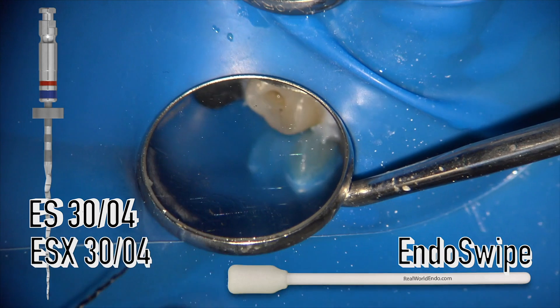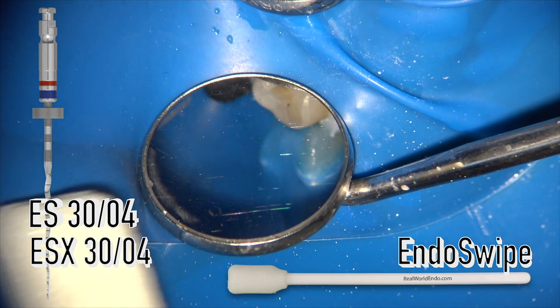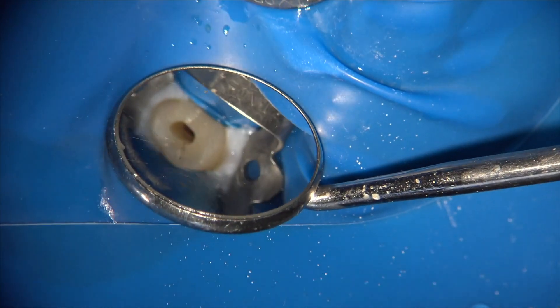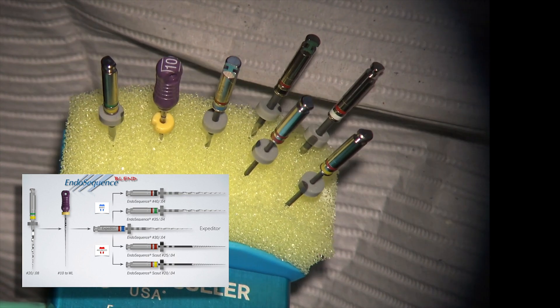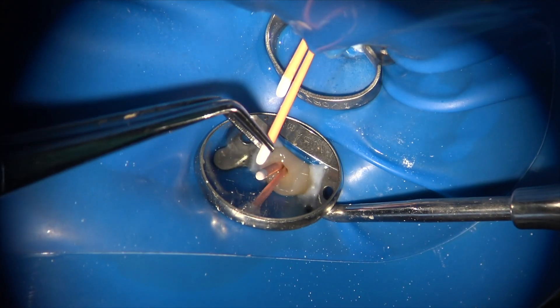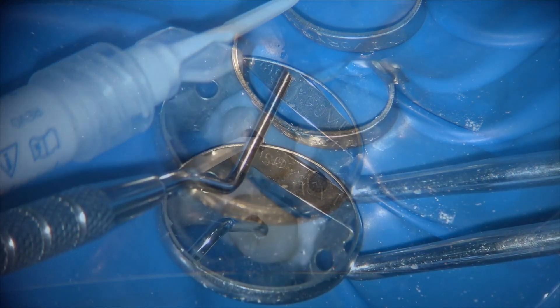If the size 30 goes all the way to the full working length right off the bat and within one or two rhythm motions, you know you're dealing with a large canal. At that point, all you need to do is determine your master apical size — the size that will have adequate engagement — and move your way up until you achieve that length. With some experience you can jump straight to the appropriate final master apical file, complete your preparation with that file, and then match it with your Endosequence BC cone and do hydraulic condensation to finish your case.